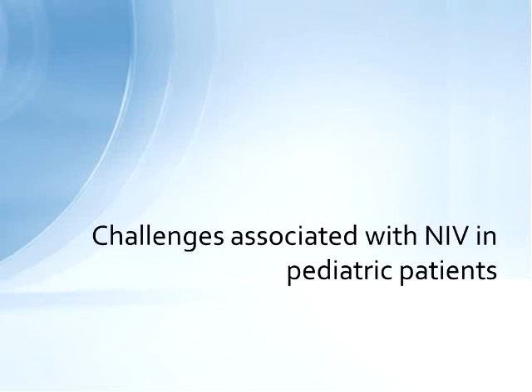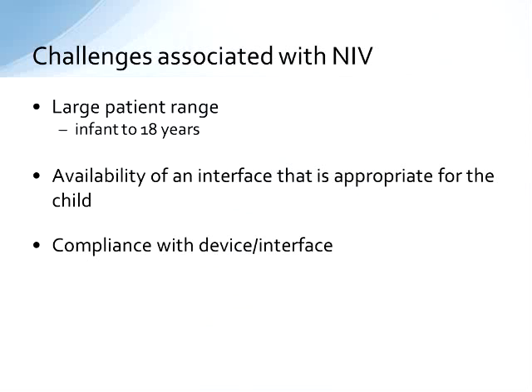So speaking of that, I want to talk a little bit specifically about the challenges associated with non-invasive ventilation for these little guys. This is pretty challenging. Those of you that work in the pediatric arena know this. We deal with little bitty babies all the way up to adults, so kiddos that were just discharged from the well baby nursery yesterday all the way up to about 18 years of age. So that's a huge swing, a huge continuum of patient size and type, and it's very, very difficult to say one size fits all with these kids, because that's absolutely not true.